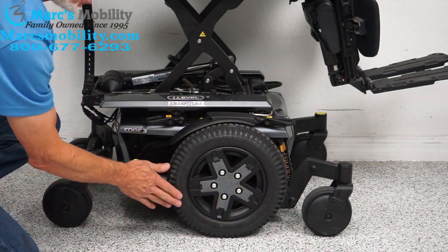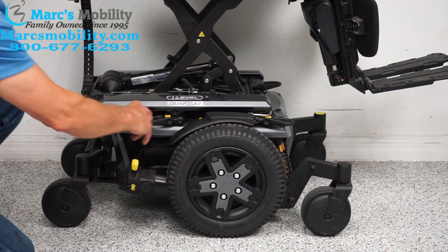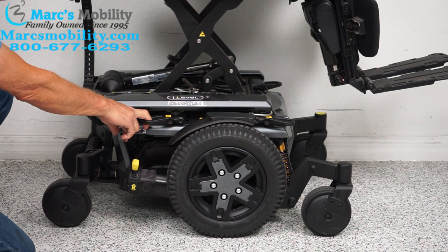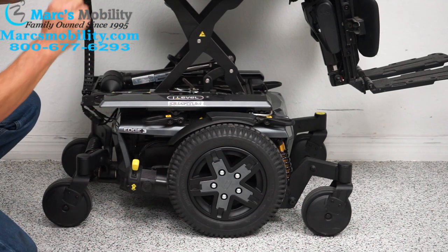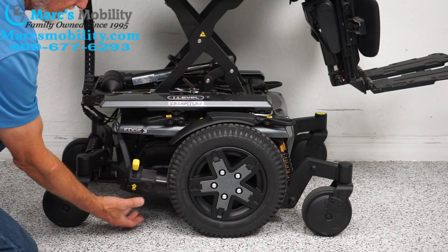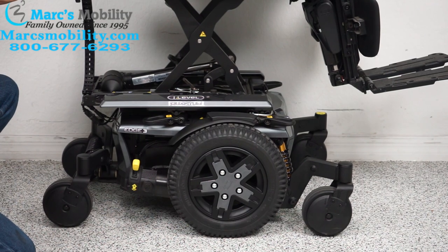We have 14-inch solid tires — they're not going to mark your floor. There's an anchor point here, and you can see how solid these are. You can secure your chair here for transportation — two on this side, two on the opposite side, four total. There's also a motor you can see on this chair that connects directly to the hub.